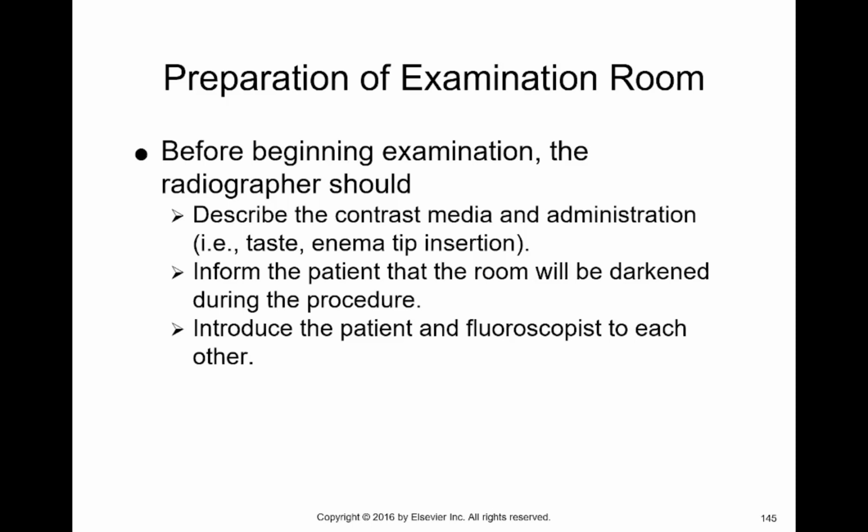Again, describe the taste of the contrast to the patient and don't lie to them. I really recommend that you take a sip of it so that you can give them a true assessment of what it tastes like. Because if you just tell a patient it's not all that bad and then you give them iodinated contrast, then again, you're going to show yourself to be a liar.